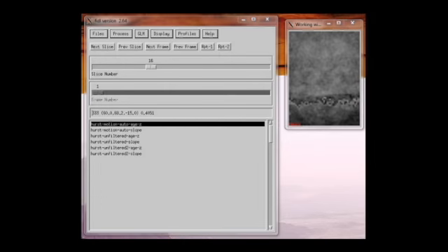It is very easy when analyzing brain imaging data to simply put one's data into the black box of the analysis and then only pay attention to the final product that is produced. However, numerous artifacts can hinder the proper interpretation of data that is treated this way. We prefer to look at the data at numerous points in the processing stream.